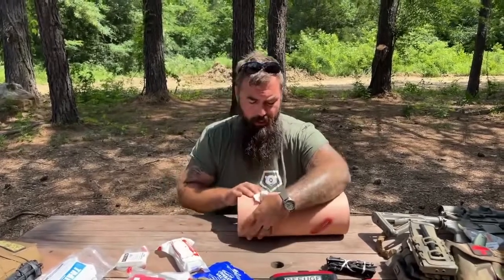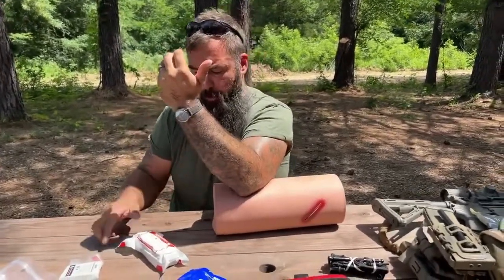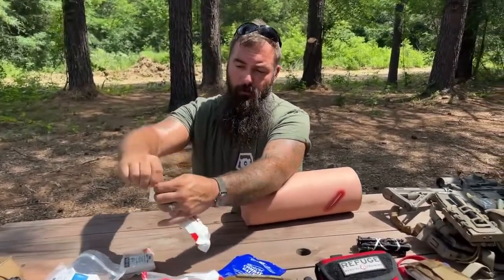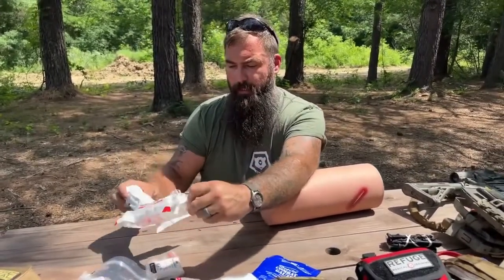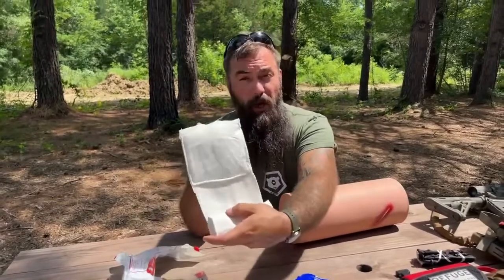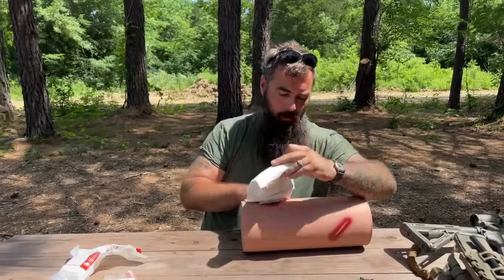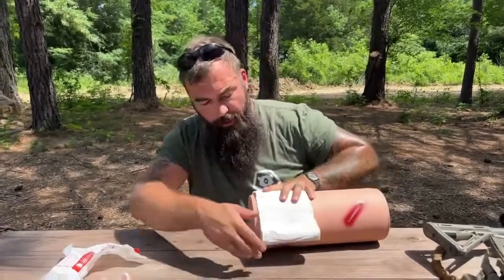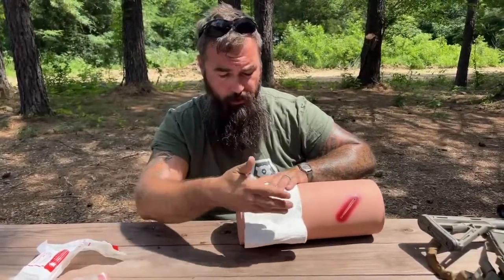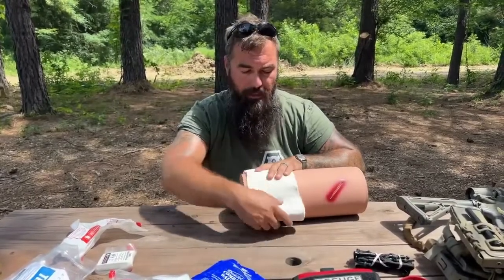I need to maintain pressure on this wound, but I also need to get the bandage open. What I like to do is drop an elbow on it and hold down pressure so I can take my time. You'll notice North American Rescue has little red tabs all over their products — that's to direct your eye to rip right there so it comes open. This is a six-inch North American Rescue emergency trauma dressing — essentially a big ACE bandage with a big gauze pad inside. I'm going to get the gauze pad over the top of the wound packing gauze and continue to apply pressure. One reason I really like North American Rescue is the intermittent hook-and-loop Velcro, which keeps this from unrolling and running away from you — that's really important in a stressful situation so it doesn't limit your ability to be effective while rendering aid.